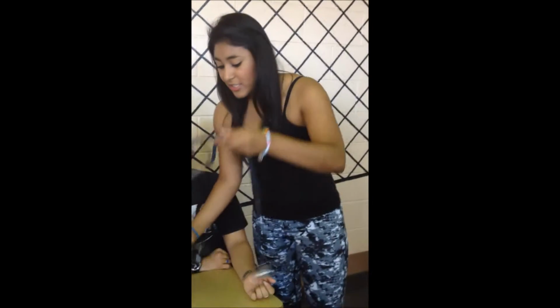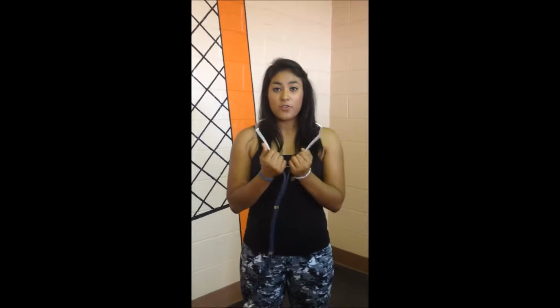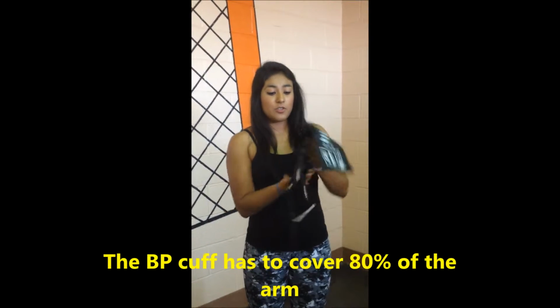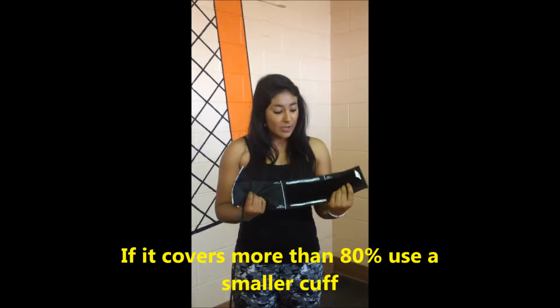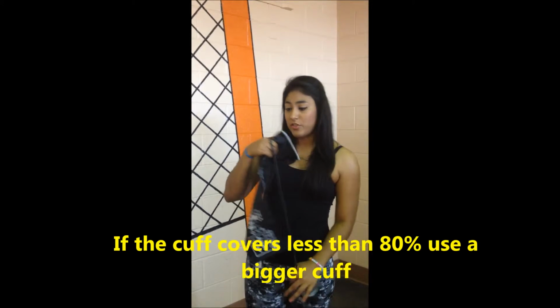To continue, our equipment is going to be our stethoscope. Make sure when you put it on the ears, the springs are facing forward. And the sphygmomanometer. Make sure when you choose the blood pressure cuff, it's the appropriate one for your patient. You might require one bigger or one smaller depending on the patient.